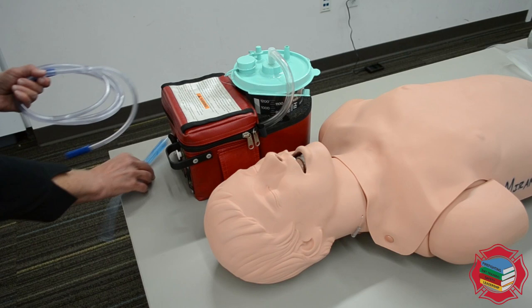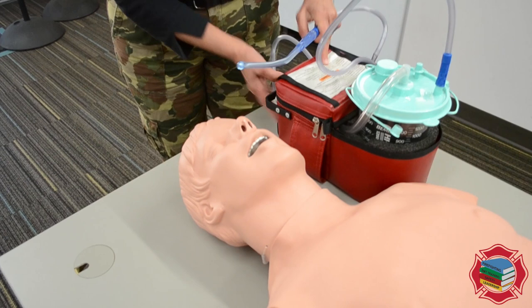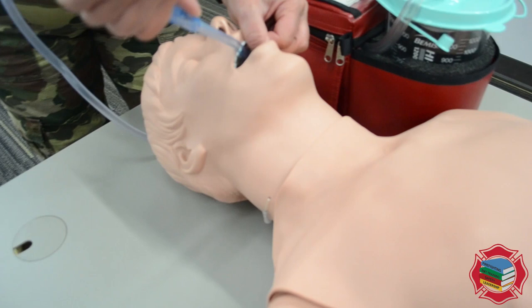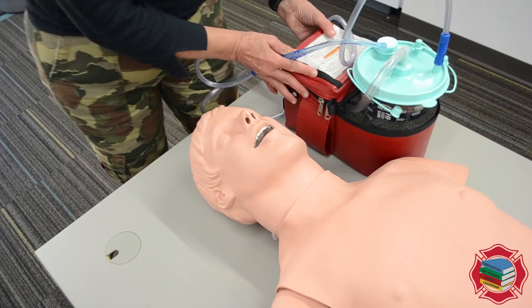Here's my suction machine. We're going to hook the tubing up here and hook our rigid tip suction catheter to the other end of it. Now I'm going to turn it on and test it, putting my thumb over the fenestration to create suction. I'm going to open the mouth and go in without suction, placing the catheter no further than the base of the tongue, then start suctioning — moving side to side or in a circular motion for no longer than 15 seconds. The mouth and oral pharynx are now clear.